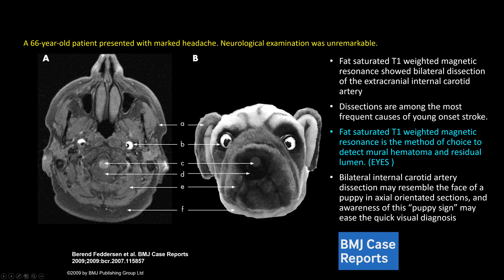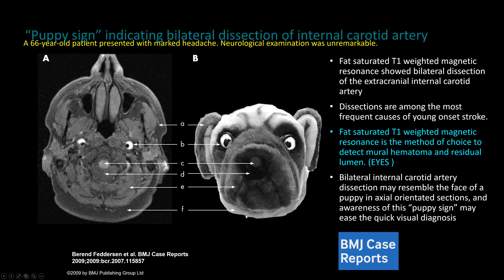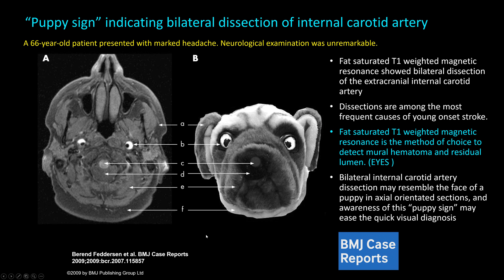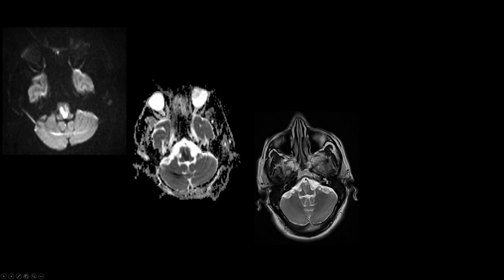This finding mimics the face of a dog or puppy sign. The residual lumen of the internal carotid artery and the mural hematoma together resemble the eyeballs of a puppy. The spinal cord resembles the nose, CSF resembles the hypointense areas around the nose, and muscles and soft tissues resemble the soft tissues of the face and subcutaneous fat. Remember the face of the dog or puppy sign for bilateral internal carotid artery dissection. This image is taken from Beren Federson et al., BMJ Case Reports, with permission.